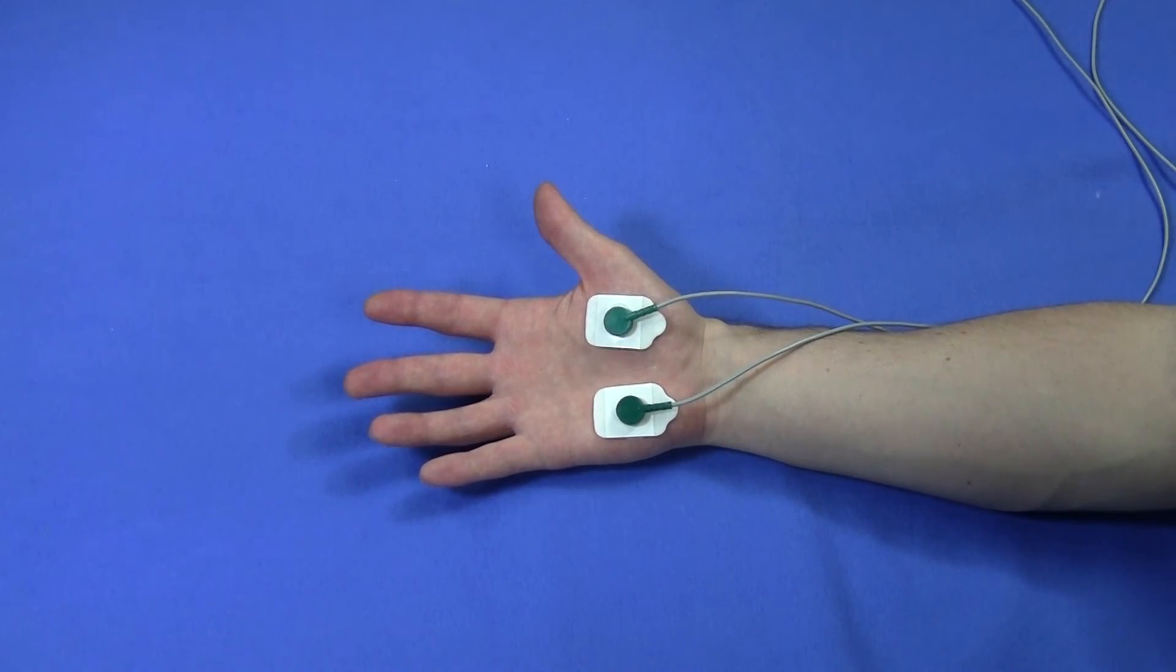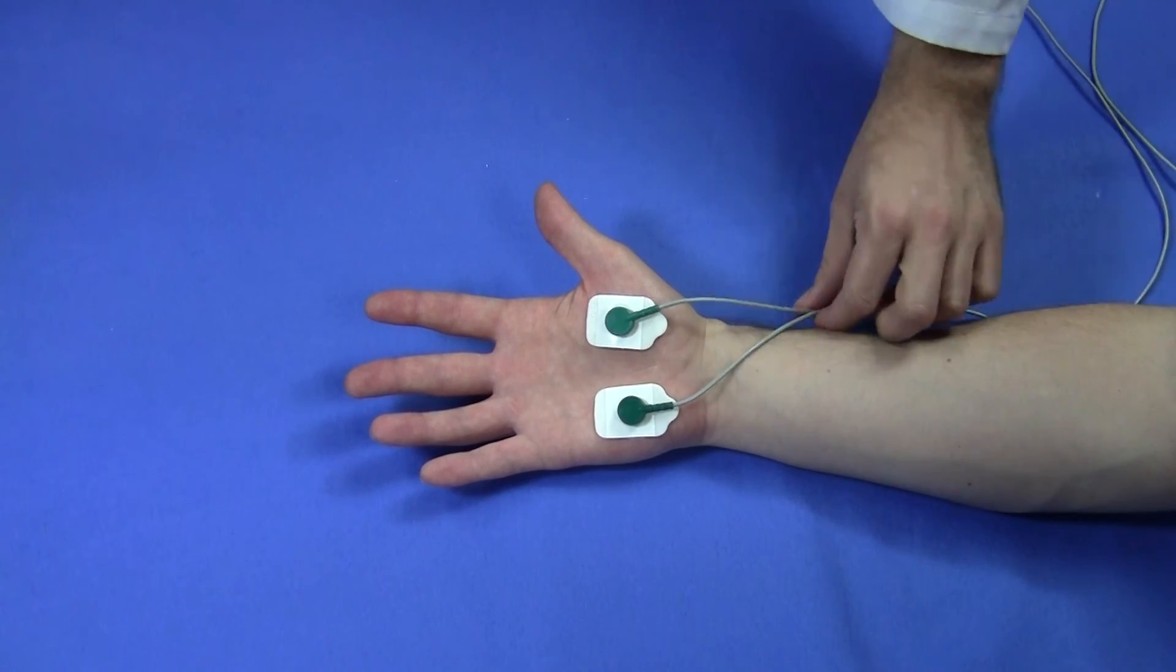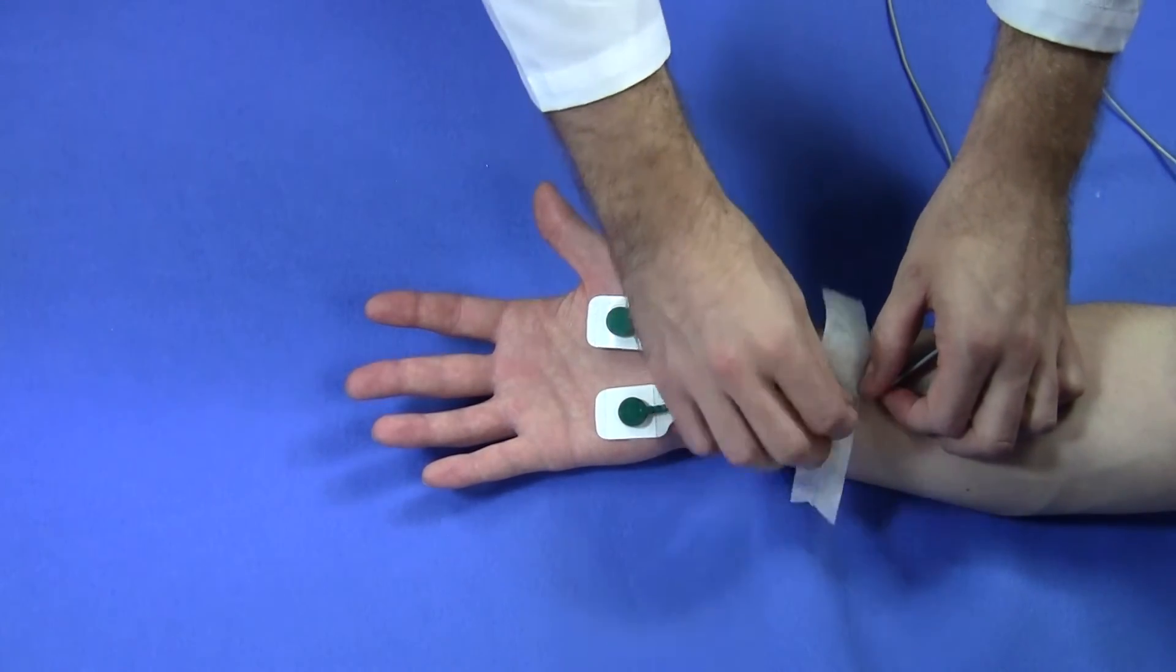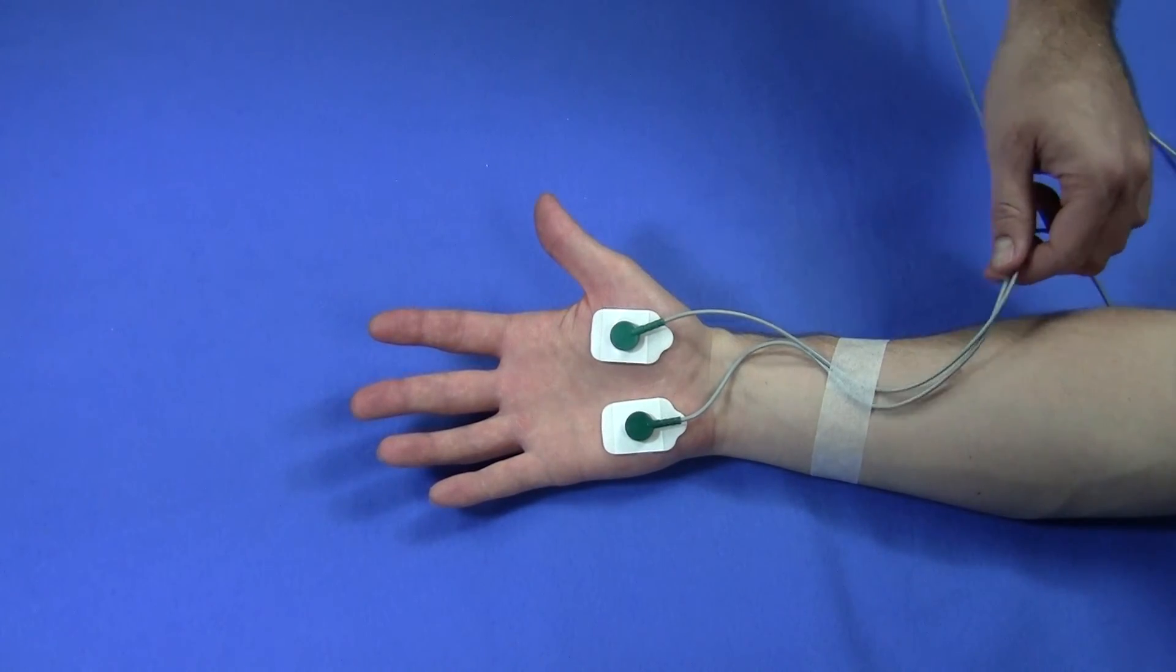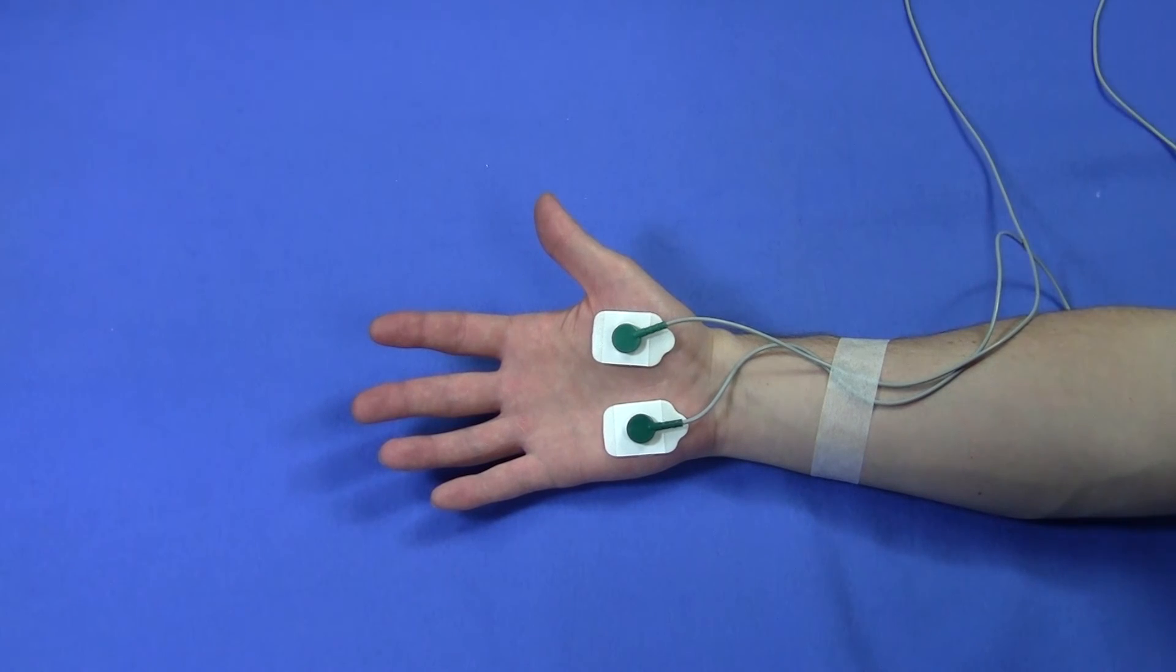Next, I'll take a piece of micropore tape and make a service loop by attaching the lead wires to the subject's wrist. This way, when there's tension on the lead wires, it's applied to the tape and not to the electrodes themselves.